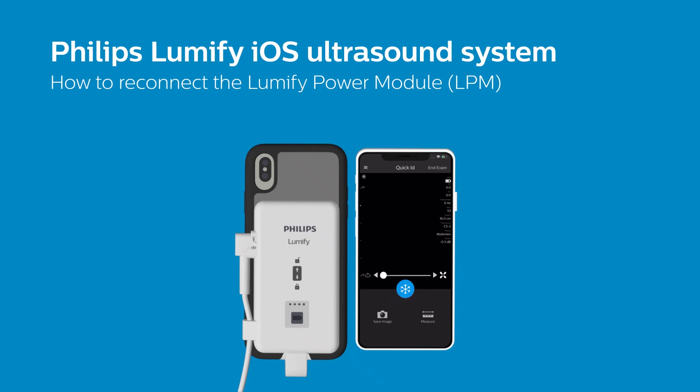To preserve battery life, the LPM will time out after 10 minutes of inactivity, or if your iOS device goes into sleep mode.